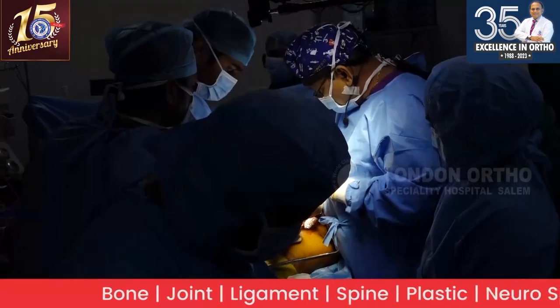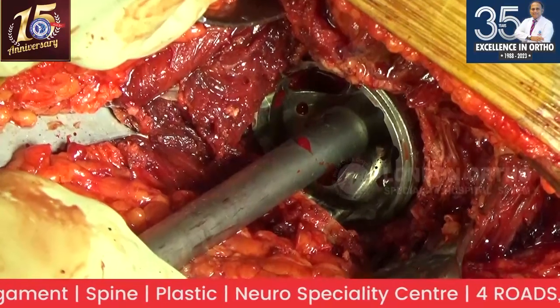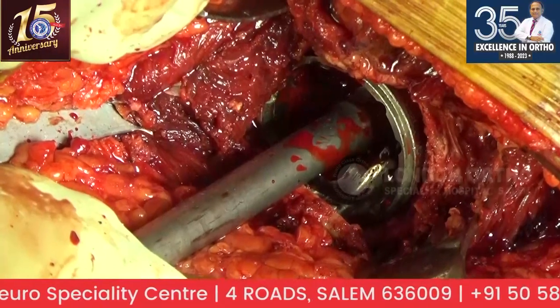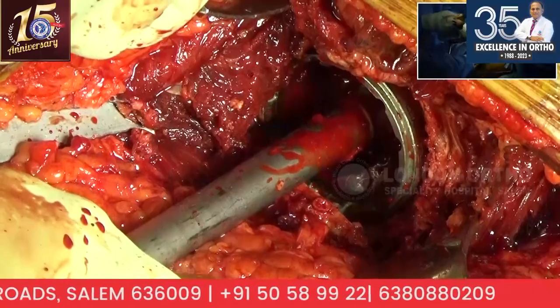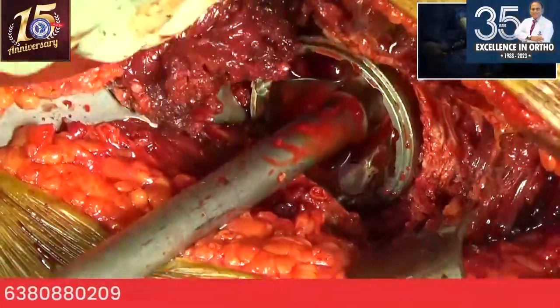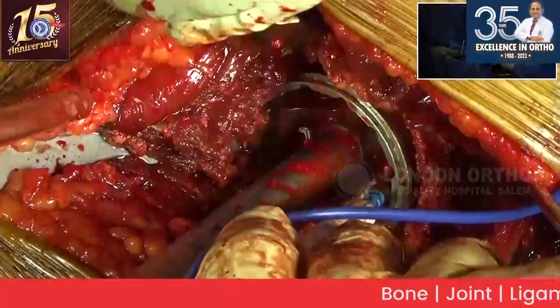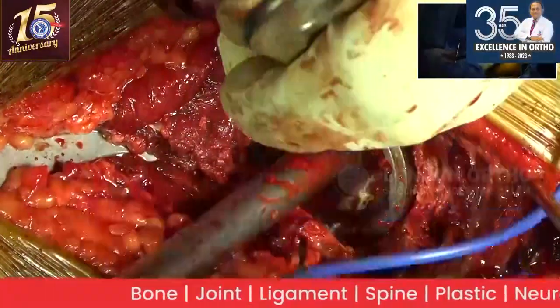What was the cup size templated? 48, I think. 48. Yeah. Hit it. Okay. Leave it. So when I see a gap like this, this is osteophyte. And I'll check whether there's any gap towards the medial wall. Central fit is not there.